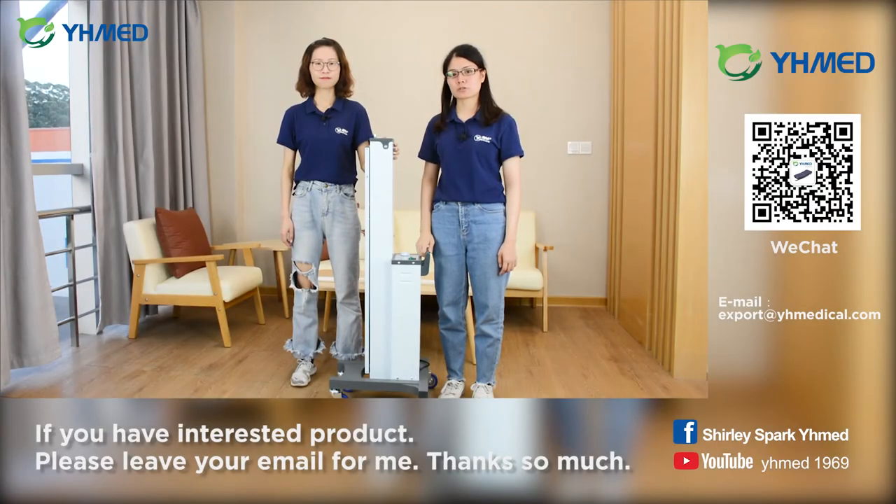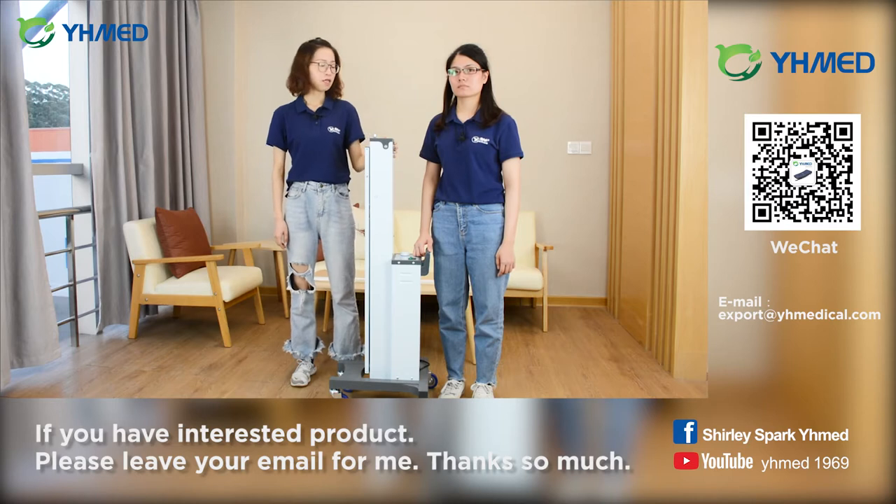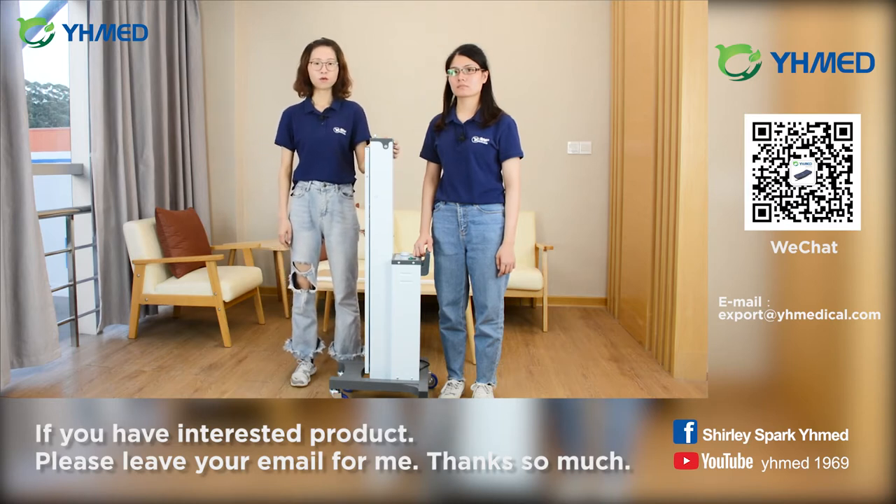Hello everyone, welcome back to our showroom. This is Pauline. Hello, this is Lydia. Today we will introduce our new product, the UV disinfection vehicle for you.